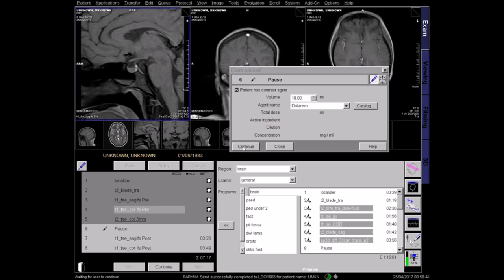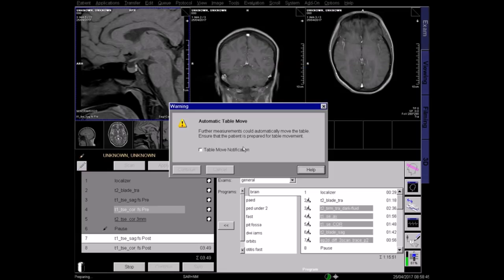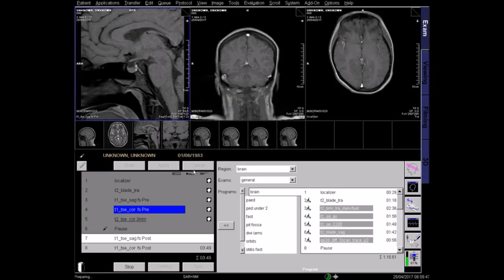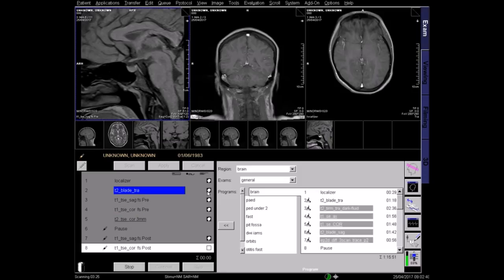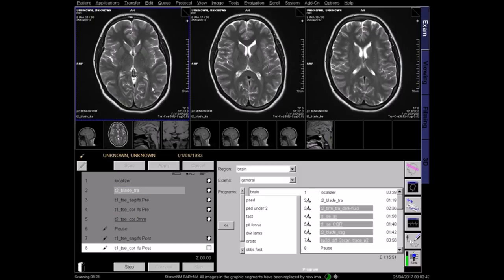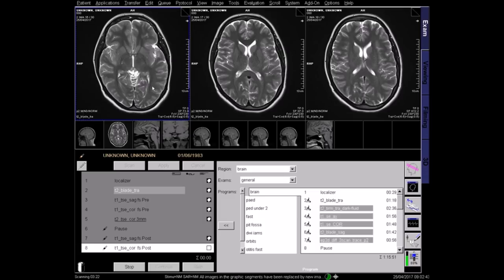Now continue with post-contrast imaging. You should have reviewed your images after each scan was acquired. Let's review them now. On all sequences we are checking the image quality and that the pituitary gland is fully visualised.